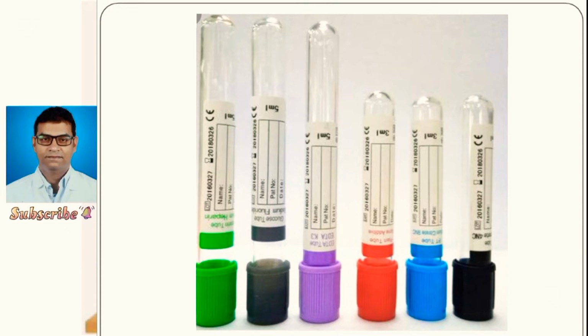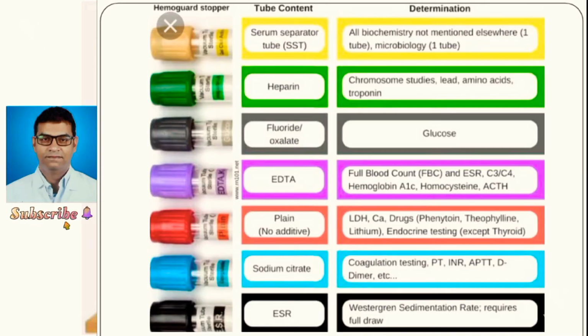Laboratory use: ethylene diamine tetraacetic acid (EDTA) strongly and irreversibly chelates or binds the calcium ions, preventing blood from clotting. Citrate is in liquid form in the tube and is used for coagulation tests as well as in blood transfusion bags. Oxalates have a mechanism similar to that of the citrates. The anticoagulants are double oxalates, ethylene diamine tetraacetic acid, heparin, sodium citrate, and sodium fluoride.